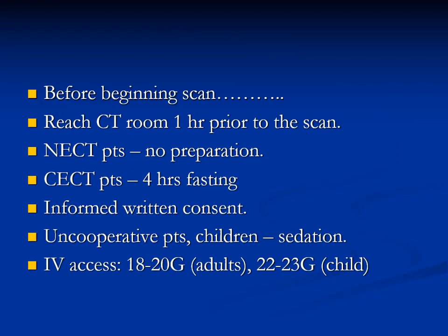Before beginning the scan, reach the CT room 1 hour prior to the scan. For NECT, no preparation. For CECT, 4 hours fasting. Informed written consent. Uncooperative patients and children need sedation. For IV access, 18-20G in adults, 22-23G in children.